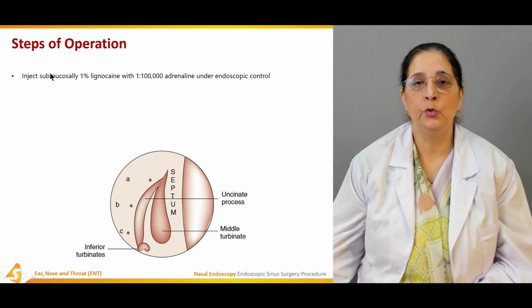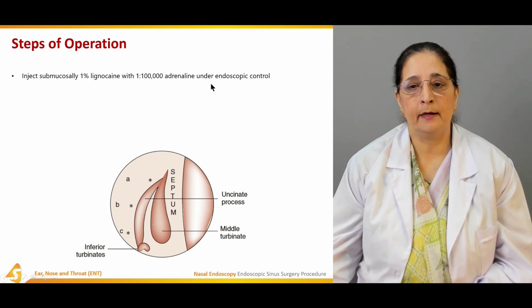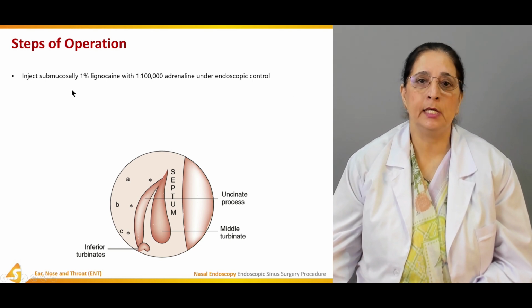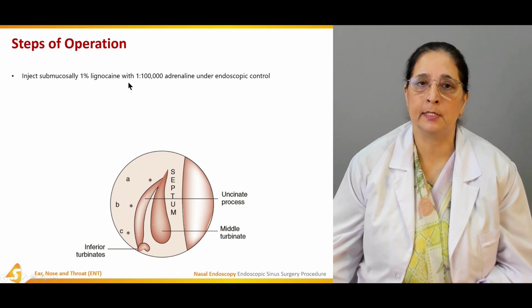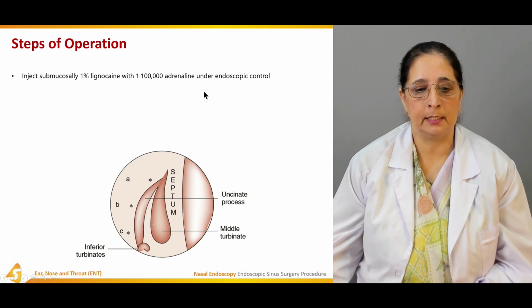Inject submucosally 1% lignocaine with 1:100,000 adrenaline under endoscopic control. So submucosal injection of 1% lignocaine along with adrenaline is given.